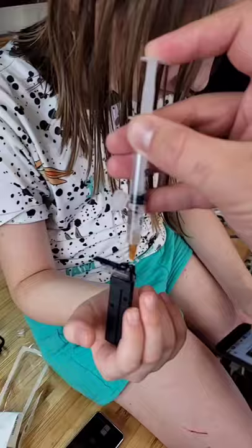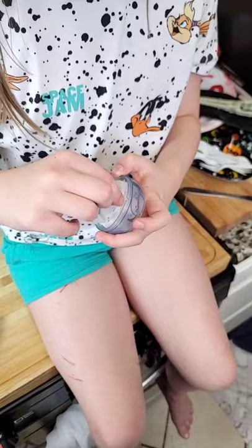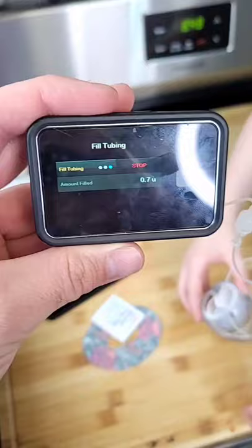And for the pump, let's fill up the pump with some insulin. Yay, insulin. Insert the insulin. Take the tubing out. Fill the tubing. When it's drippy, we're done.